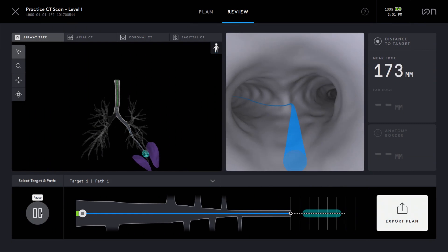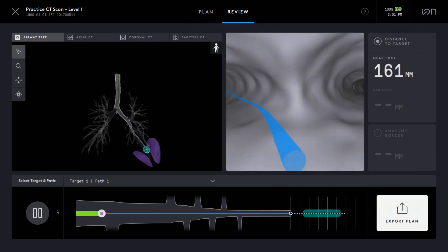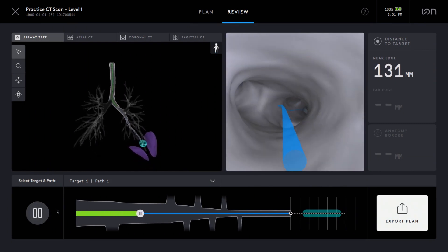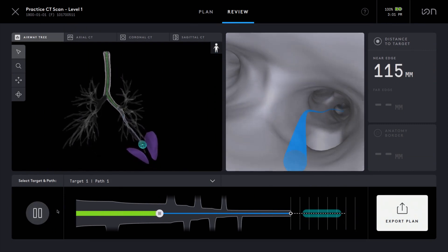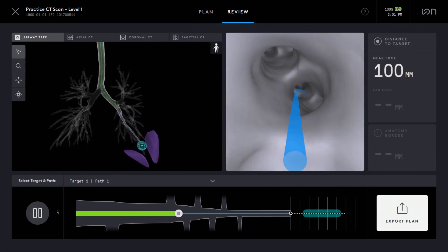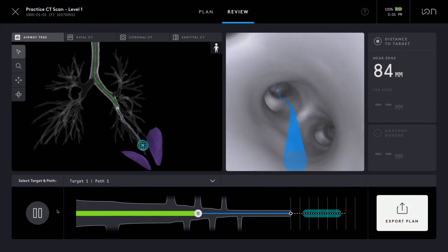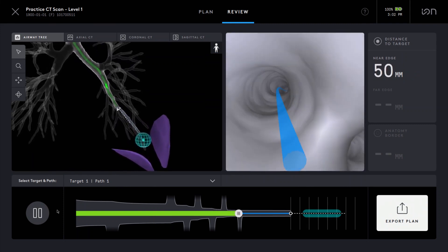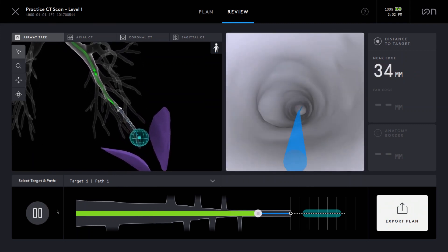The Ion Plan Point software's segmentation capability provides physicians turn-by-turn navigation guidance, enabling physicians to reach far into the peripheral lungs and perform biopsies.